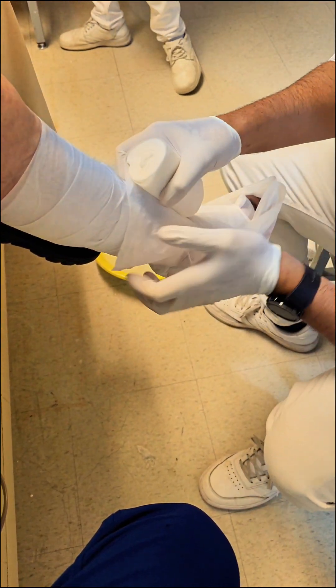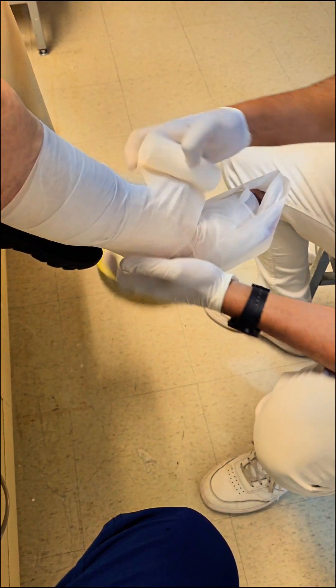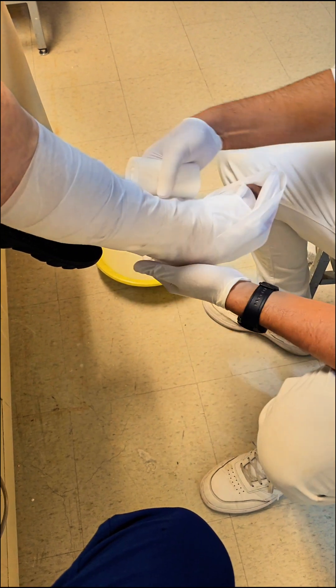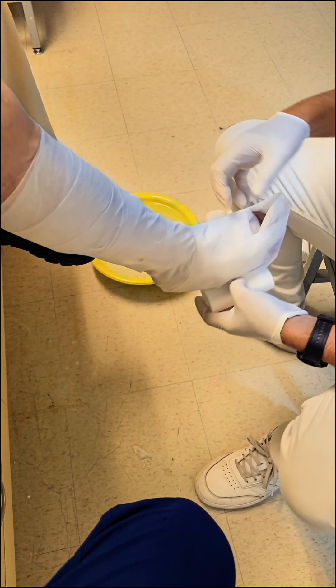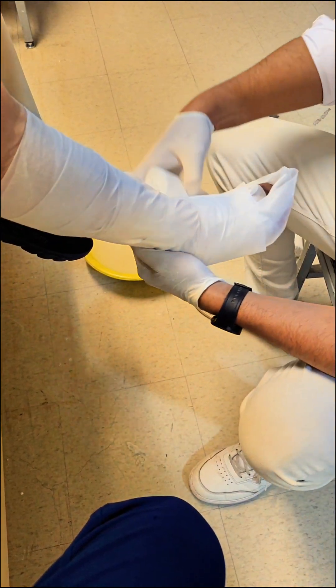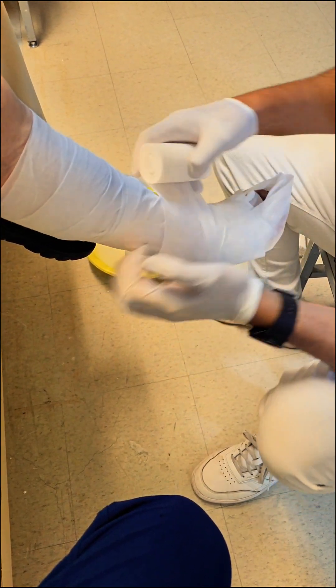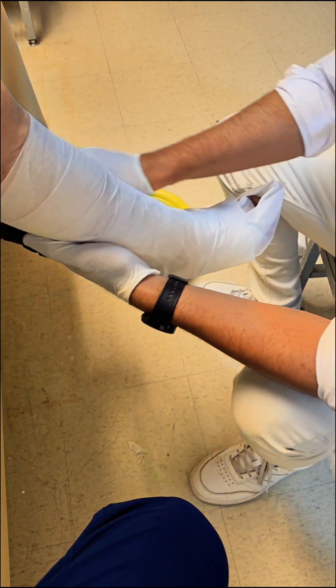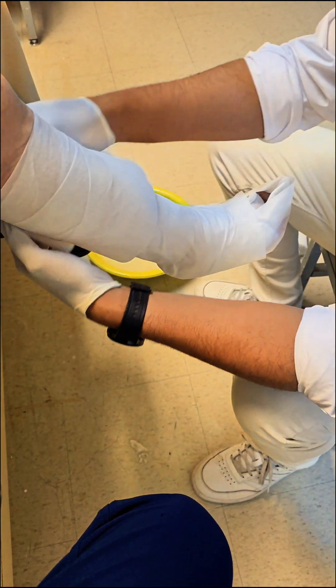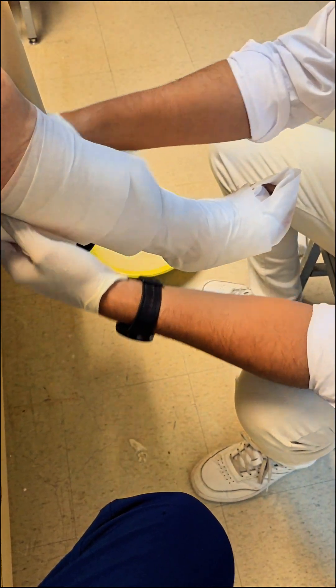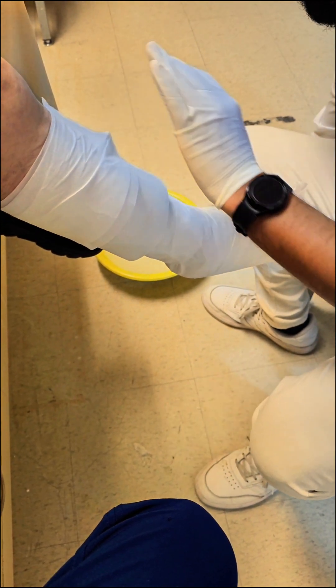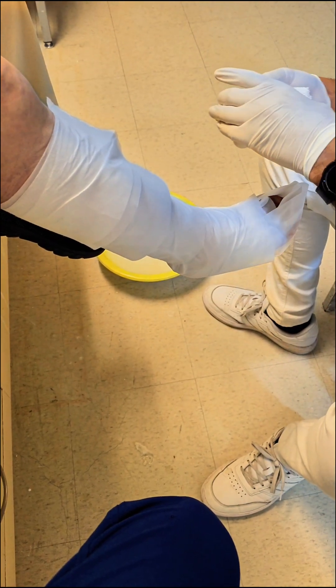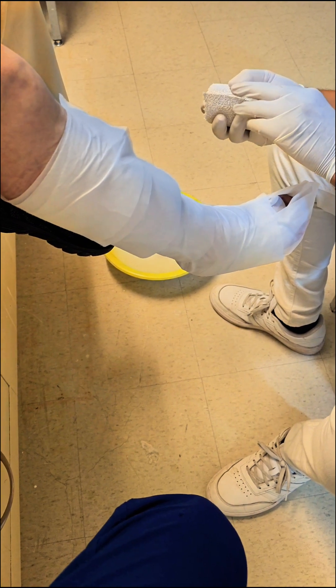Before we get into the actual casting process, it's important to understand why different foot fractures require different types of casts. The foot is a complex structure with 26 bones, and each fracture can impact your mobility and recovery in different ways. Choosing the correct type of cast depends on the location and severity of the fracture, as well as the patient's activity level and overall health.